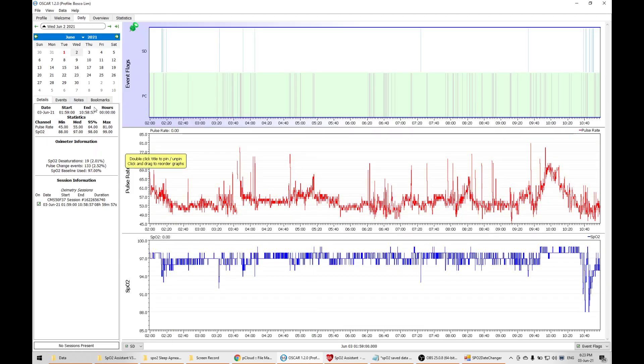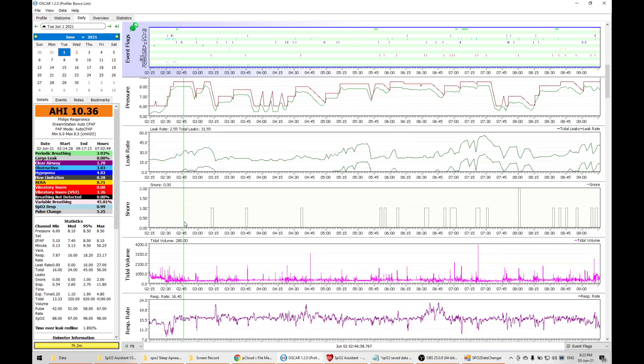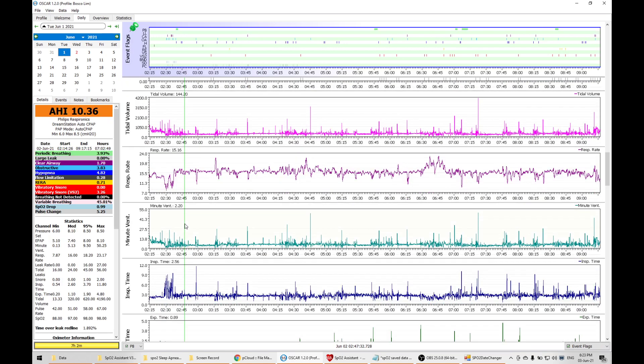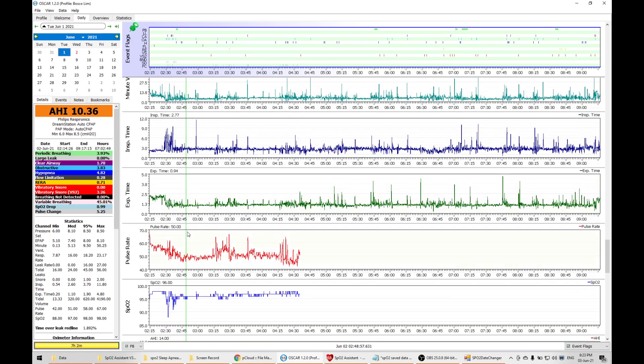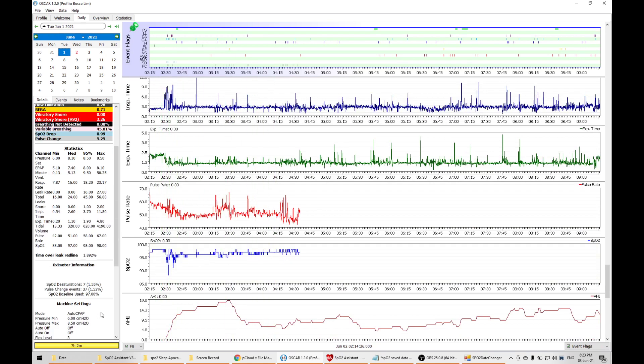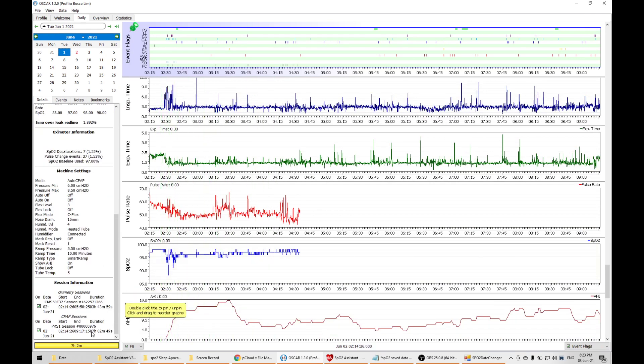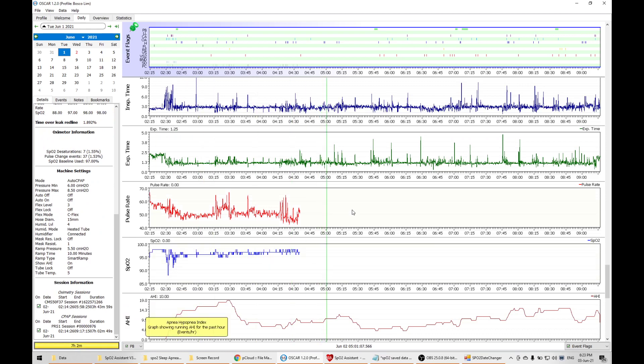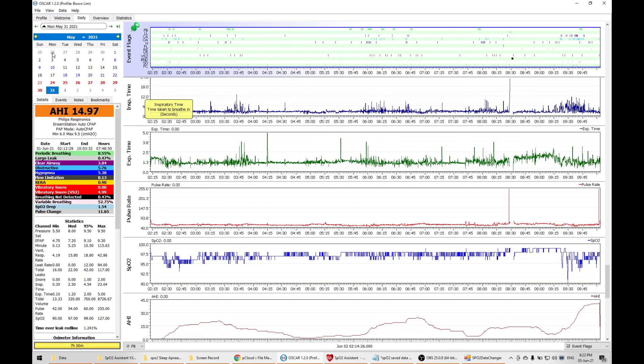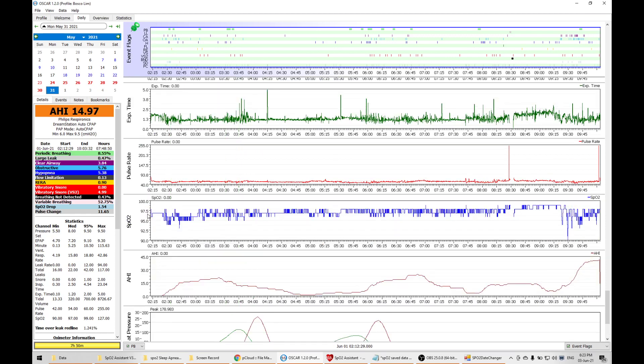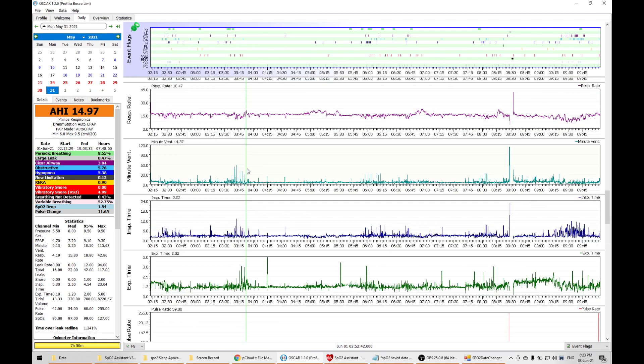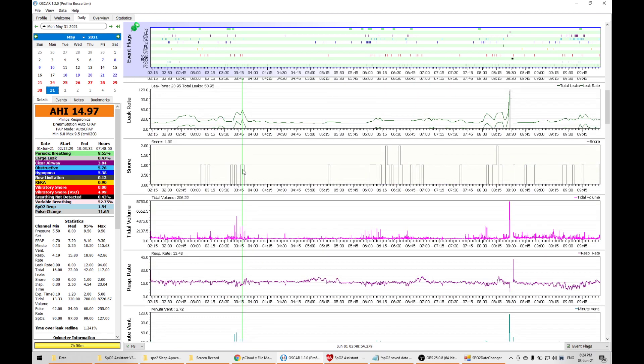This is the previous day. I actually messed up the details back then, so there are two sessions. That's why you see this break. Normally it should be seen like this—the SPO2 with the pulse rate will synchronize with the sleep apnea machine.